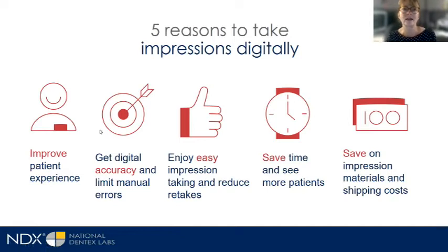So what people will often ask, why go digital, right? And this is an older slide, but it's still very accurate. We have data now that statistically proves that a good digital impression is more accurate than a good polyvinyl siloxane impression. Typically for the patients, it's a much easier process. It can be an exciting process for them. It can be a tool for the dentist to use in properly educating that patient on what their dental health is and the needs that they might have. Once you are proficient, it definitely saves you time in taking a scan versus a PVS impression. And then, of course, the overhead of the impression material long-term.